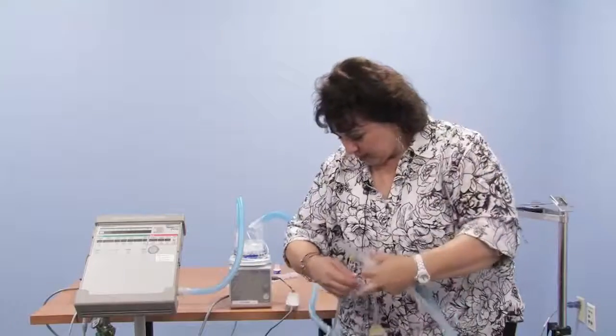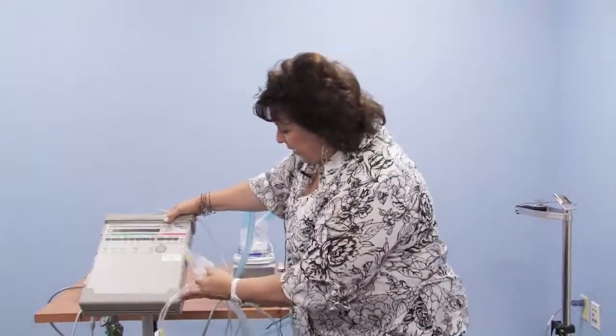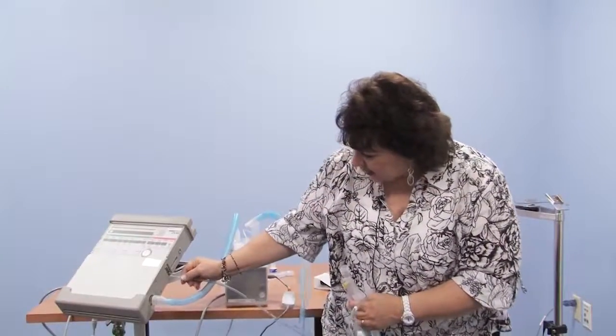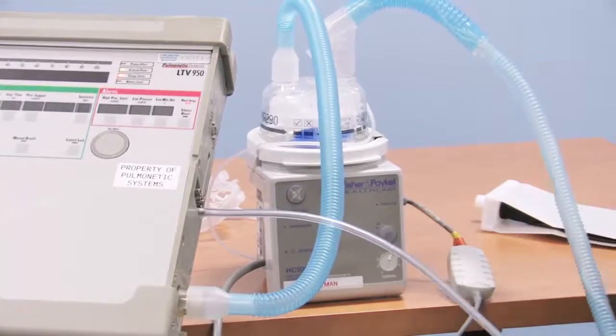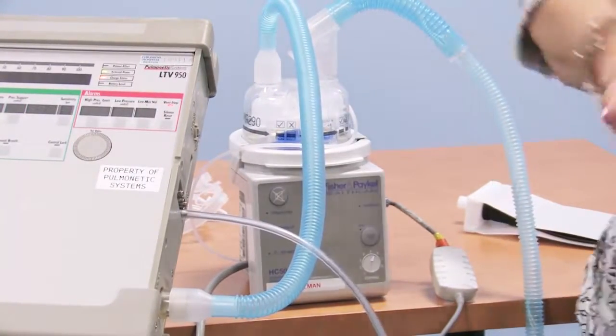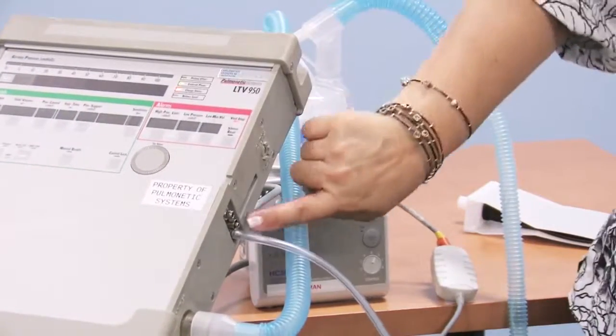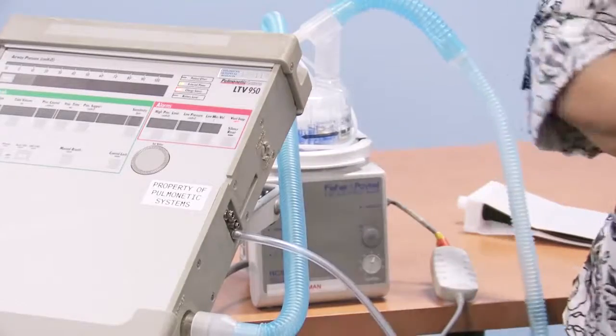So this hose takes us to the plain hose at the end, and we're going to connect it where it says exhalation valve, and it pushes right onto the machine. The other 2 hoses are color-coded. For those of us that aren't colorblind, there is yellow and white, but if you look at them, they only fit specifically onto each one of these in a certain way.